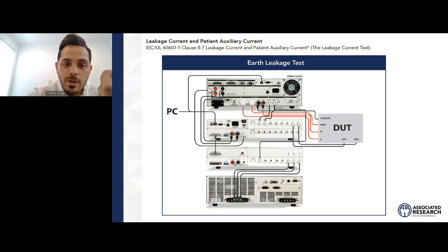So now we have access to your mains, and we also have access to your grounded chassis via this case connection, okay? It's almost like there's no connections to show because it's all done internally on the Omnia, right? I have mains coming through here, which is accessible internally on the Omnia. I'm connected to the chassis via the case.